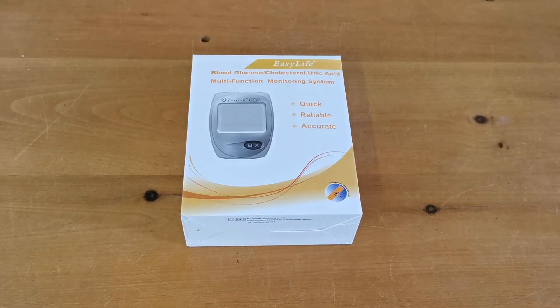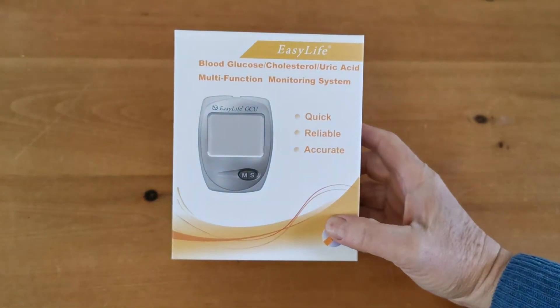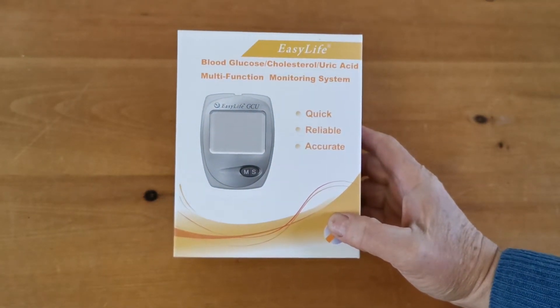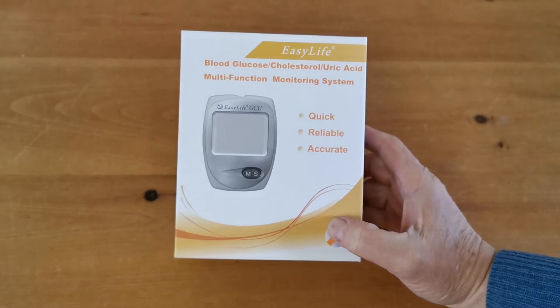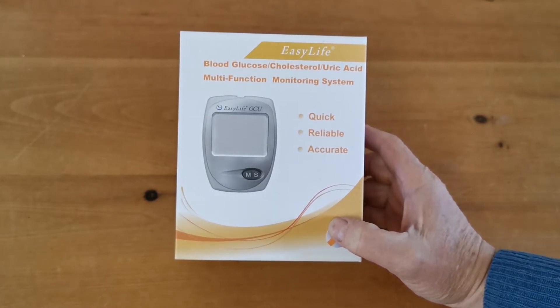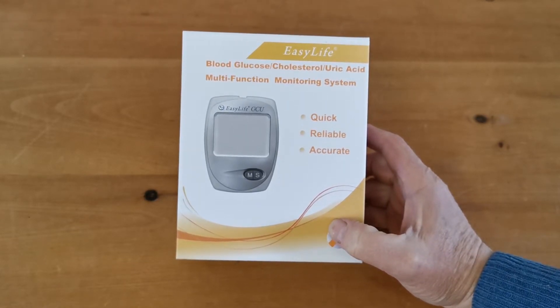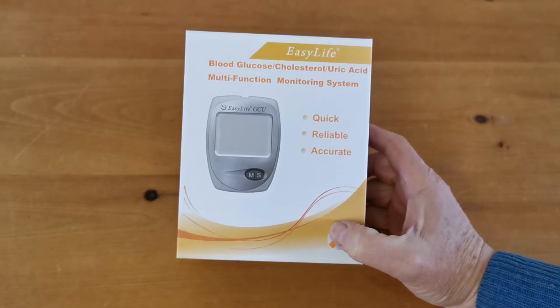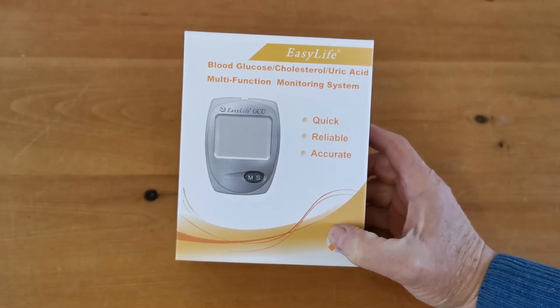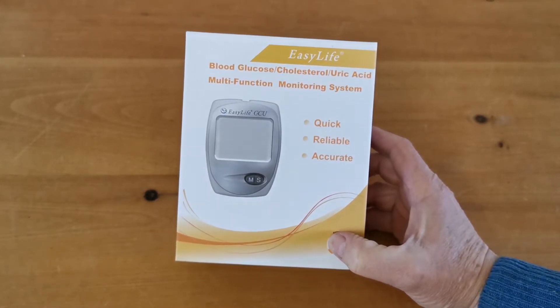Welcome to this product demonstration video for the EZLife blood glucose, cholesterol, and uric acid triple meter. This is a single digital meter with the ability to use three different sets of test strips — individual strips for blood glucose, blood cholesterol, and uric acid. In this video playlist, we'll take you through what you get in the box, the meter setup, and the procedure for taking blood samples and running a test.